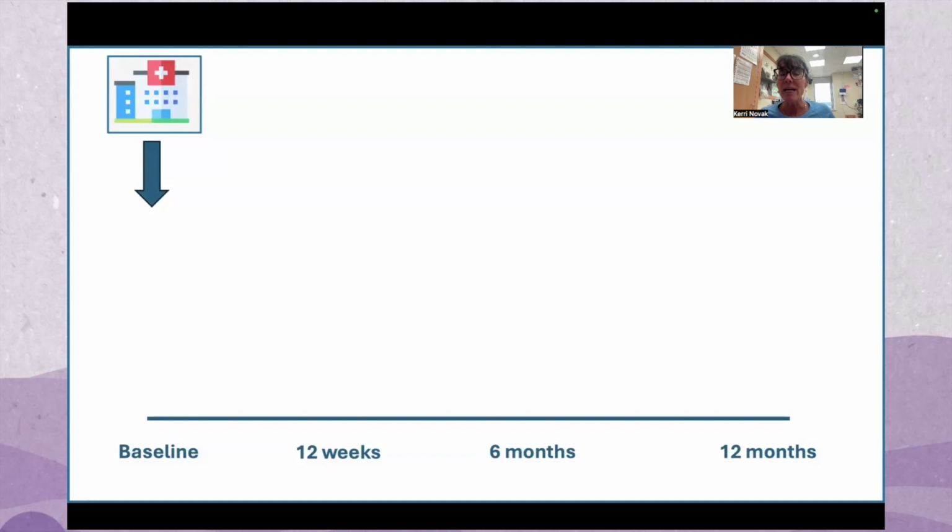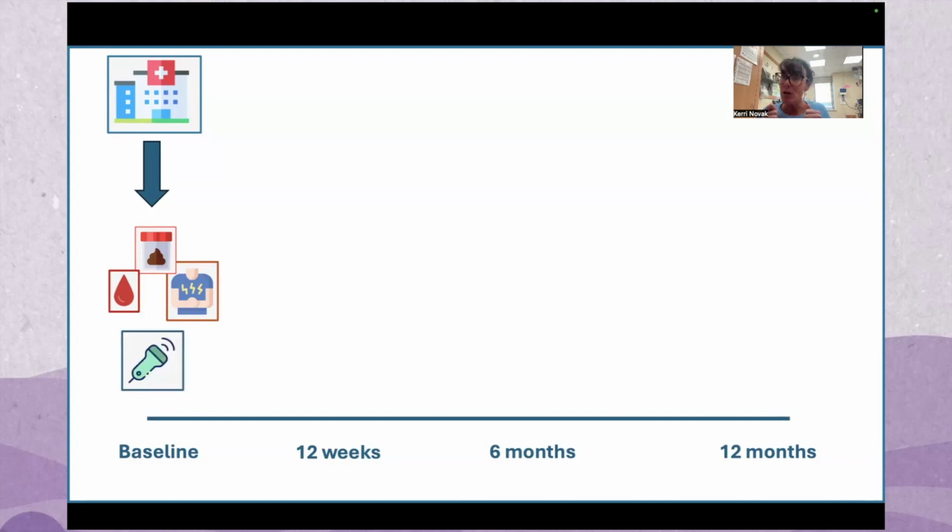How would we bring this into your care path? Well, for sure, once you've had a colonoscopy and you've had a diagnosis of ulcerative colitis or Crohn's disease, or you're symptomatic, and we want to understand whether you need to have a colonoscopy in order to get a diagnosis, you would come to the clinic and we would do blood, stools, make sure you don't have an infection, and listen to your symptoms. Then we can do an ultrasound and comprehensively look at your entire bowel.